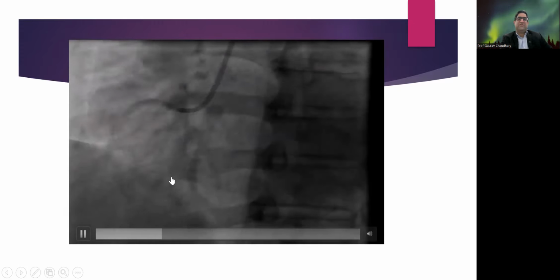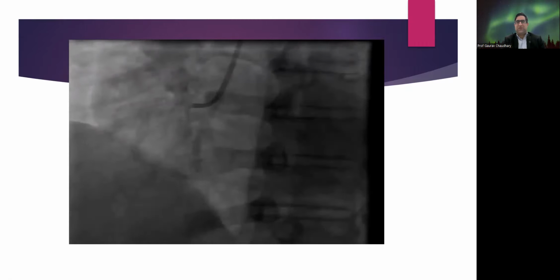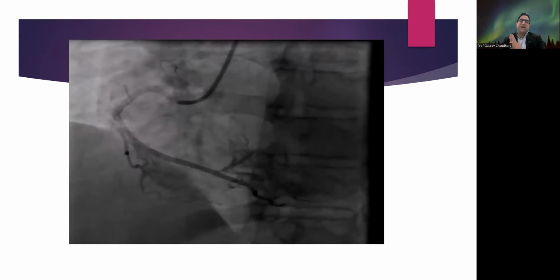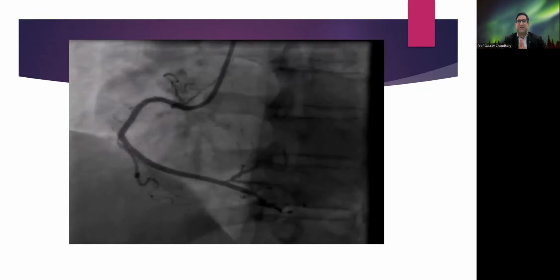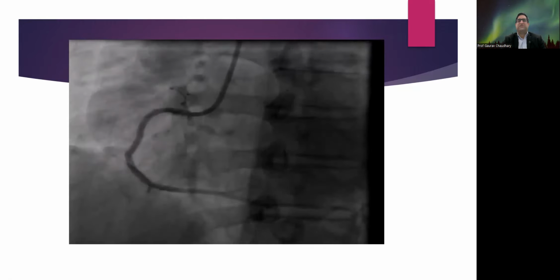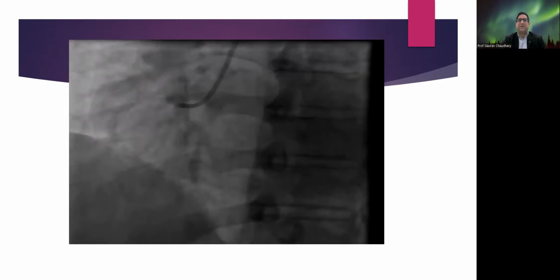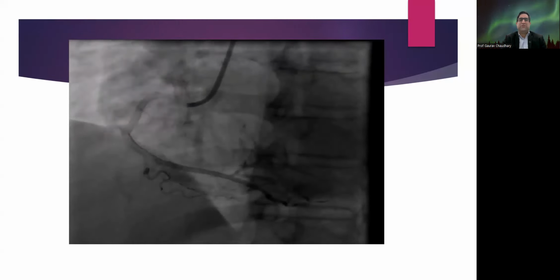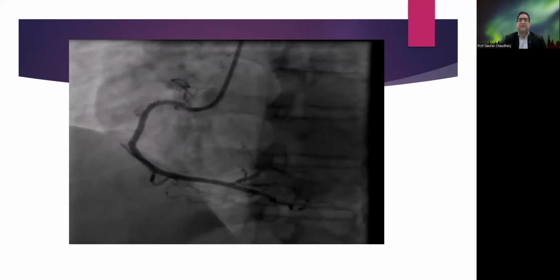So this was the end result. This is how we discussed the judicious use of the FineCross, Caravel, and this Corsair Pro XS. These are some of the most common microcatheters that are available nowadays, and they have led to increased success of CTO PCIs, either antegrade or retrograde. So we have to keep in mind which microcatheter to take in which case, and that is going to help us very much.